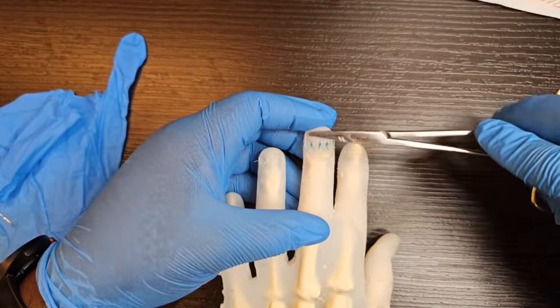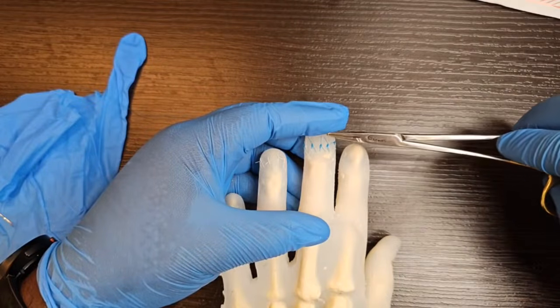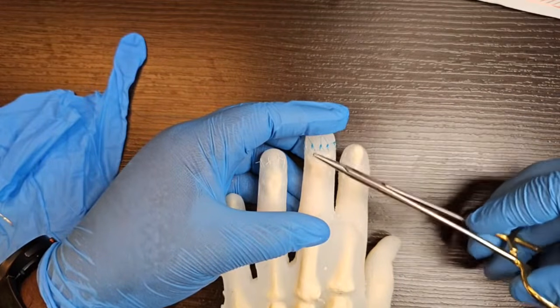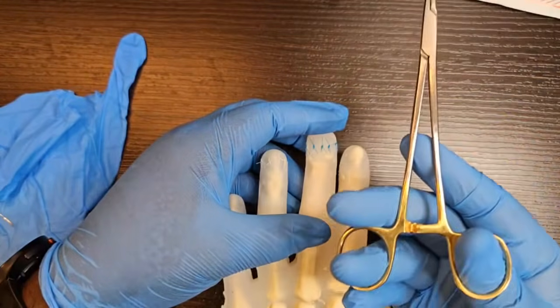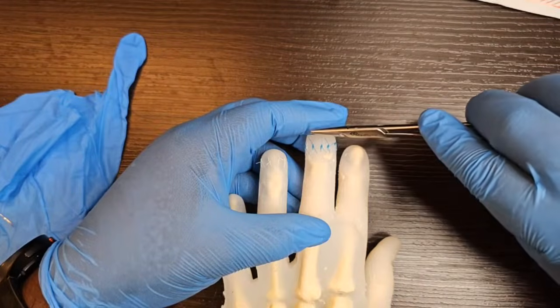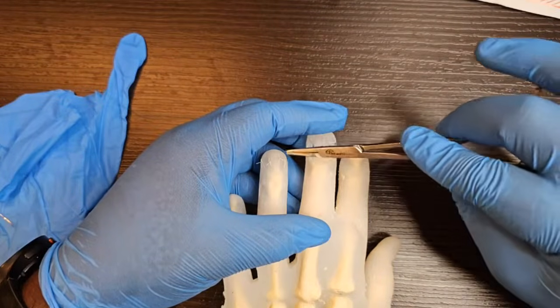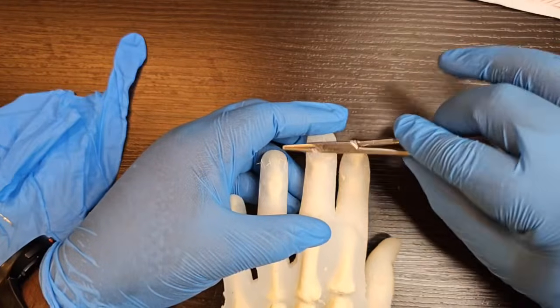In terms of economy of movement, the nail bed is very thin. You often hit the bone very quickly, so I like to palm my needle holder. I place it, and I rotate it by just rotating the needle holder in my fingers. It's just this movement, rotation.